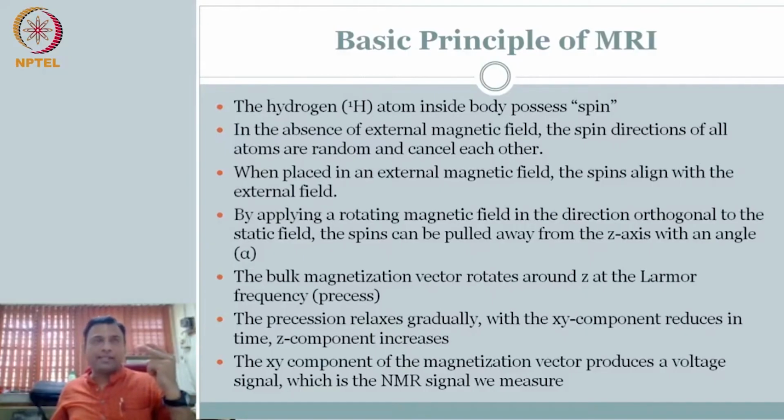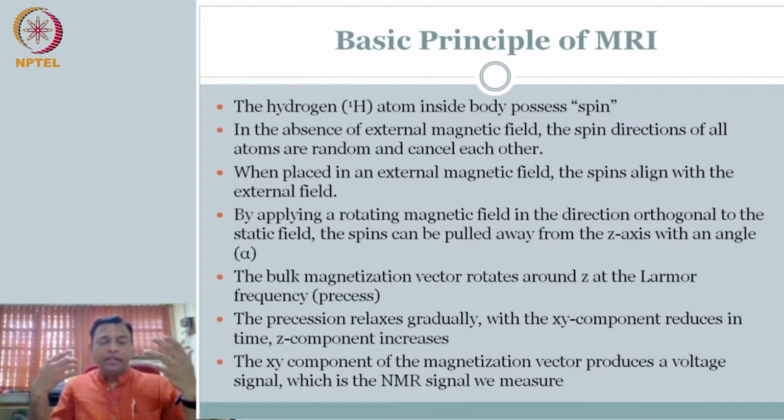We talked about two aspects. One is that the nucleus has protons, and the protons spin, right? Especially since we are water bodies, we will almost always be interested in the hydrogen atoms because there is so much H2O, right? For every molecule you have two hydrogen, so you have so many hydrogen nuclei. And so we talked about something that is spinning.